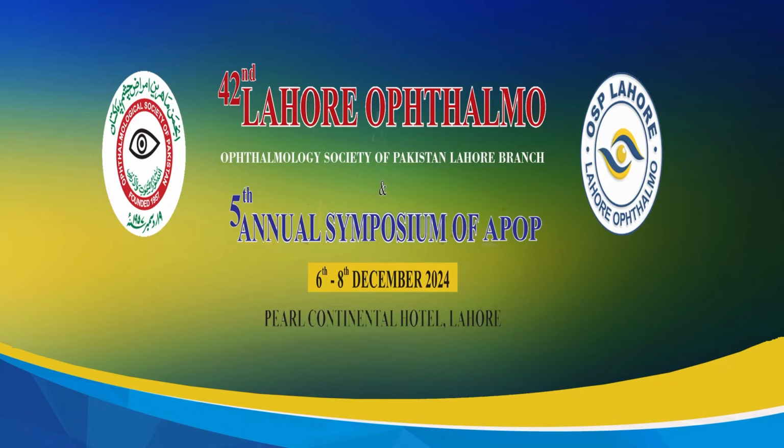सो मैं एक चीज़ ज़रूर करता हूँ कि कोशिश तो करता हूँ कि जितना क्लोज एज पॉसिबल, लेकिन एक जगह के आगे डेंजर हो जाता है. ऐसी जगहें हैं जहाँ मैं एक आध ब्लड के पीछे बाहर से क्रायो आखिर में ज़रूर करता हूँ कि वो जगह अगर कवर नहीं हुई भी और वहाँ से कोई खिंचाव आता है तो वो जो एक आध स्पॉट क्रायो का है वो उसको काउंटरैक्ट कर लेगा. क्रायो बिकॉज यू कांट डू लेजर थ्रू ब्लड बट यू कैन डू क्रायो.